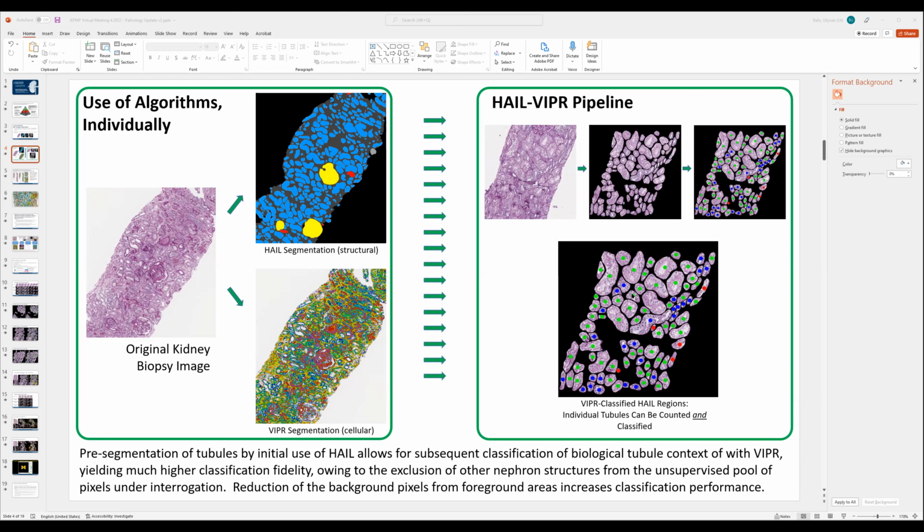So that's this. So in order to validate what these dots are, what the completely autonomous pipeline generated, we needed a collaborative tool for pathologists to share their grades or their assessment of each tubule, which is hundreds and hundreds of clicks across multiple tiles. And this lightweight tool allowed them to do that and send back tabular data. So that was the intent. And you can see we had this for literally hundreds of images.